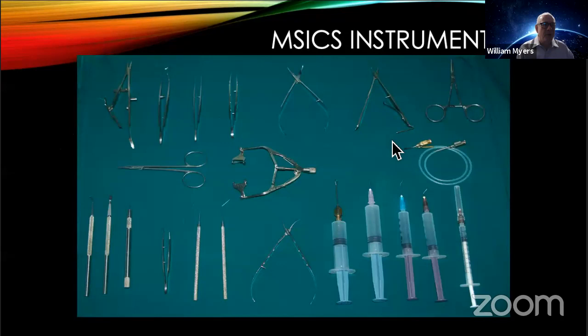There are a number of instruments used in MSICS surgery. Most of them are ones you're familiar with. The two that you might not be would be the Simcoe needle, which is soldered together with two barrels coming out, and the other is the irrigating vectis, which goes on a saline syringe. These others are all instruments you're probably used to, with the exception of the crescent knife, which allows for an easier scleral tunnel.